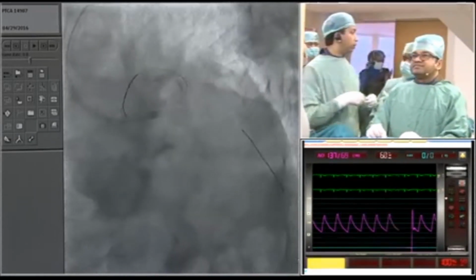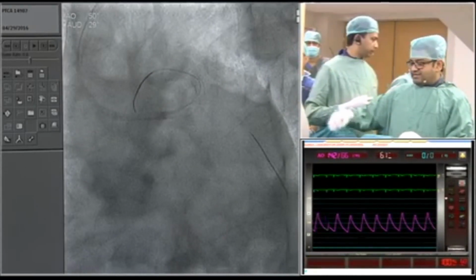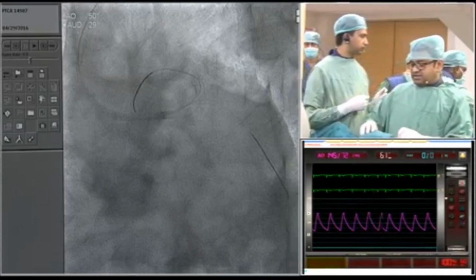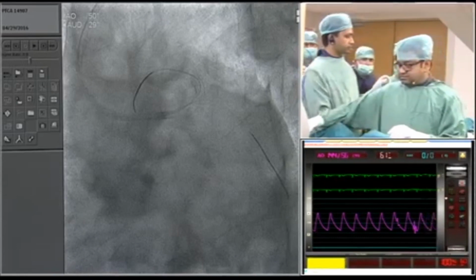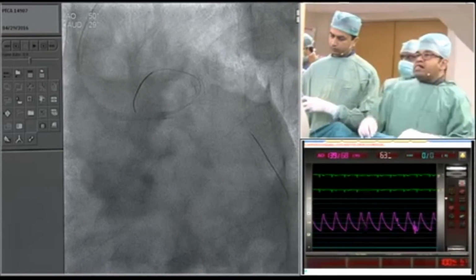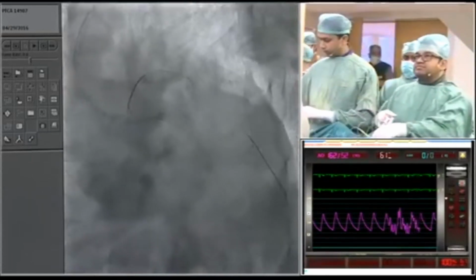I ran with colleagues a randomized trial, not in left main, but in many occasions. But it was with the DR drug-eluting balloon, and the results were not really amazing. We published the study in Catheterization and Cardiovascular Intervention a couple of years ago. The DR is also the less performing of the drug-eluting balloons on the market. So I think one reason was the balloon itself.